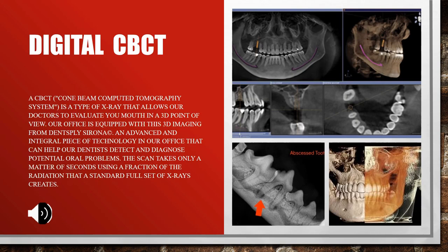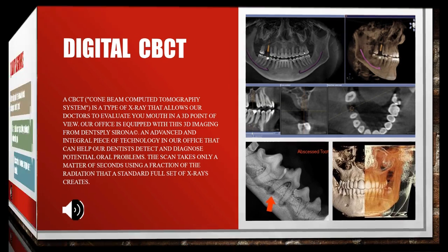Digital x-rays, known as CBCT, cone beam computed tomography, is an x-ray which is more commonly being used. This presents us with a 3D point of view and may be useful in identifying a number of potential issues, as well as being diagnostic for treatment planning. This allows us to identify bone density for implant placement as well as a number of other issues, which may be abscesses within the patient's mouth, but also various defects within the bone itself.